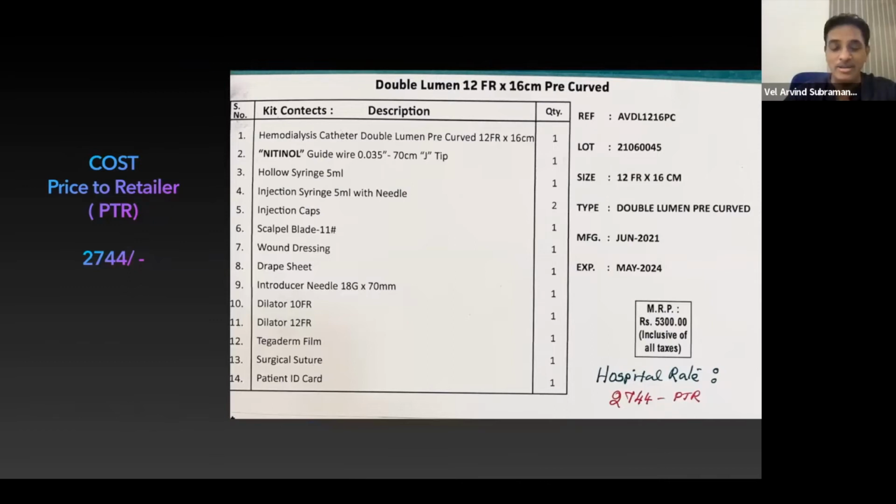But for poor patients, in my priorities, we are doing a lot of kidney transplants. Down the line, in 3 months they go for a transplant. We don't create an AV fistula. In certain patients, there is some delay in processing the donor. We create an AV fistula, or else we just keep this catheter for a few months, 1 or 2 months, till they undergo transplant. Just prior to transplant, if they don't show any kind of exit infection, tunnel infection, or episodes of fever, I'll take them through the transplant. As I pull out this catheter, I put in one more catheter inside the theater.